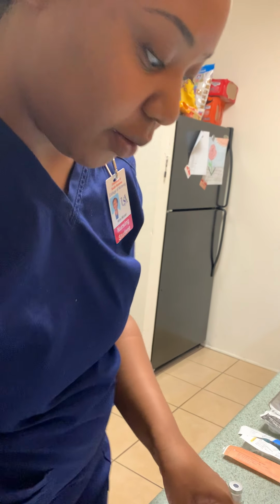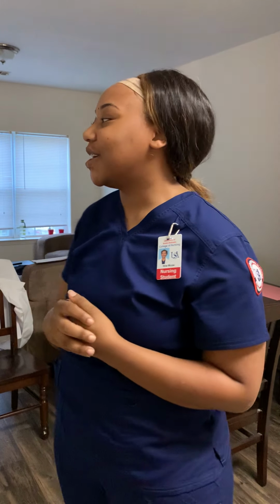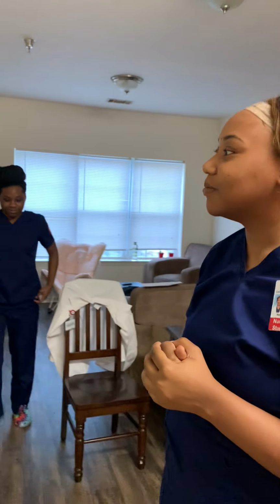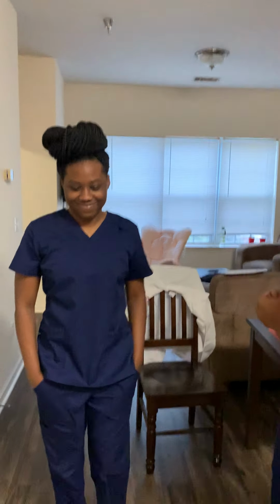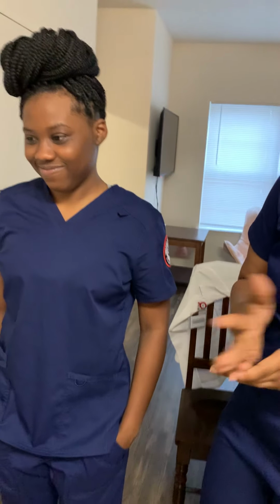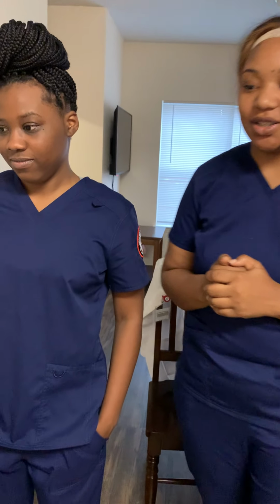All right, next I will go on to show my injection sites on my volunteer. So I have my volunteer here, and I will be giving my dose of heparin subcutaneously.